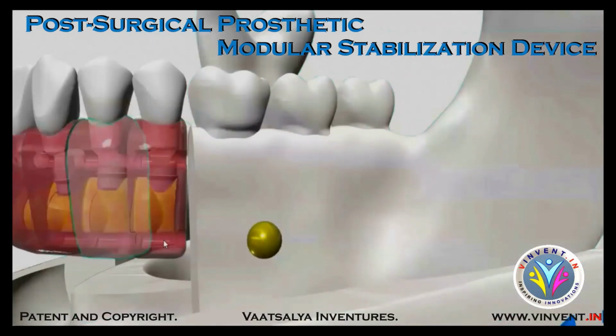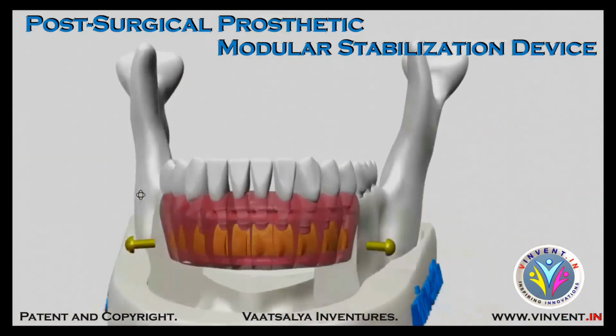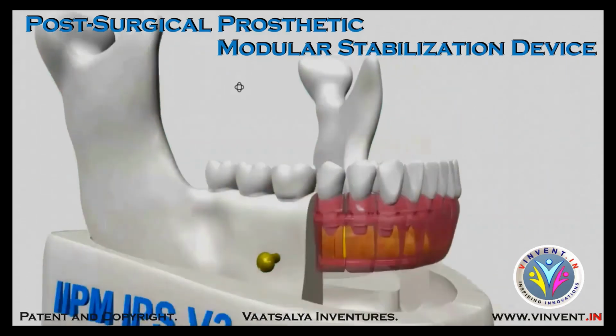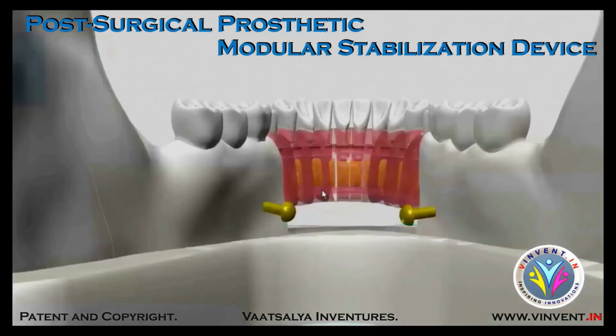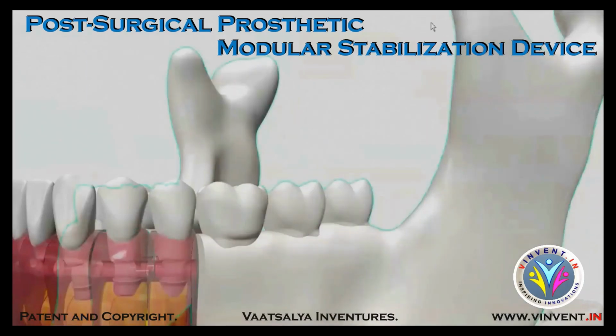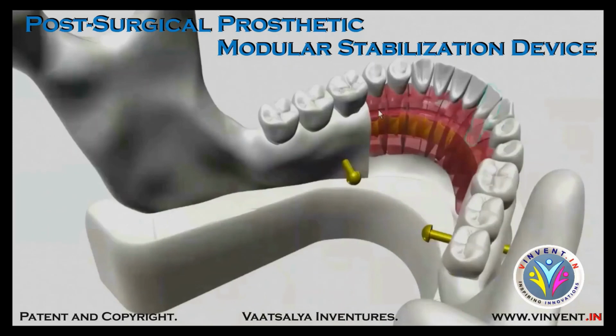Mini screws have to be employed, especially in the level of lower retention wire, which can be coupled and braided to engage with mini screws on both labial and lingual sides, allowing to counter and balance against destabilizing forces. Retention wires on the upper level can be anchored between interdental spaces of teeth to secure the device.